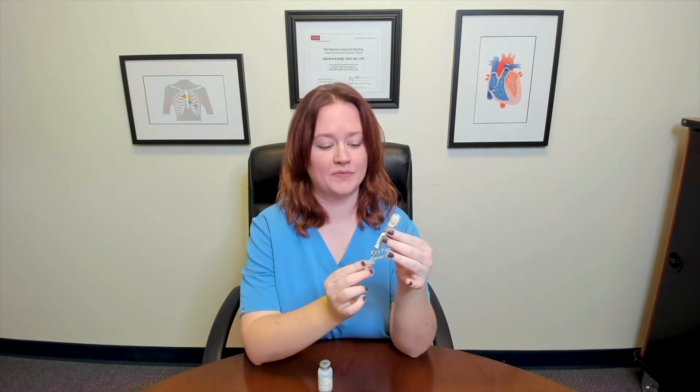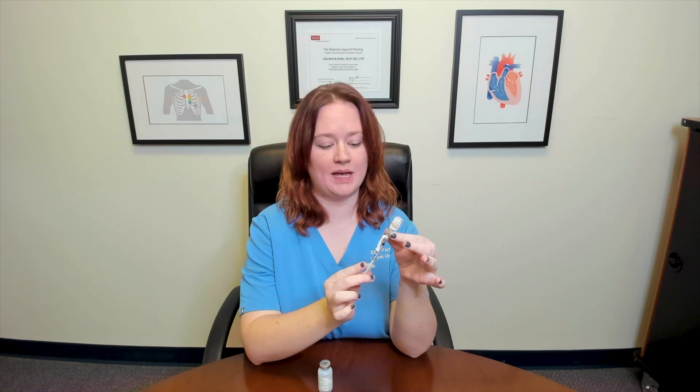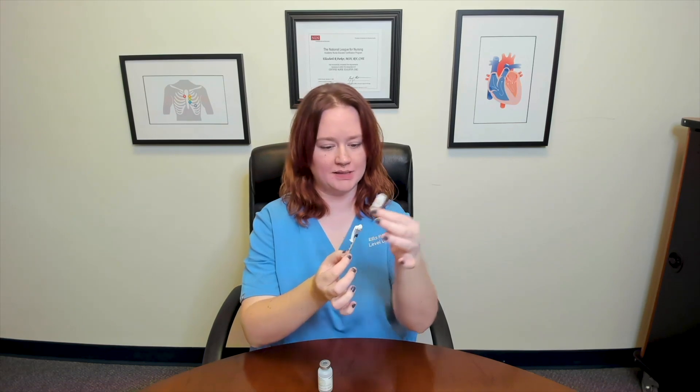Then without taking the needle out, I'm going to invert my syringe and my vial, and withdraw the plunger to five units. I've now got my five units of clear insulin.